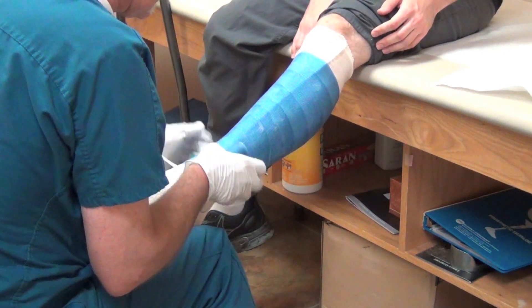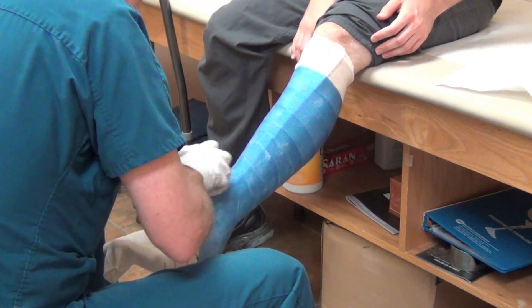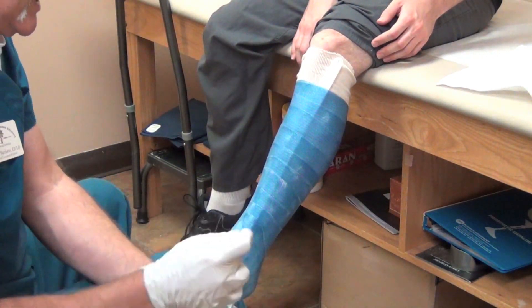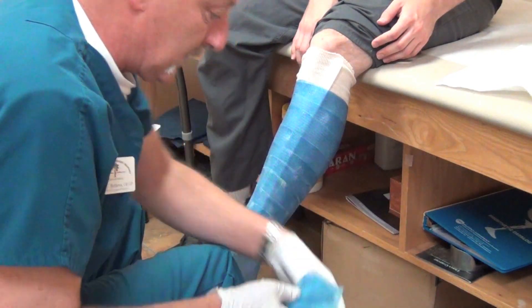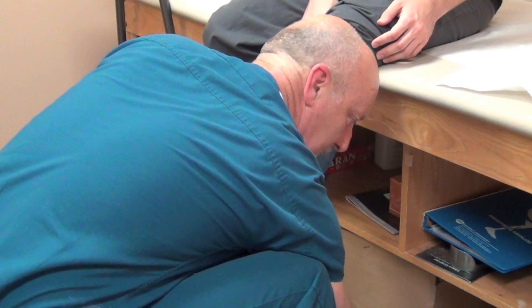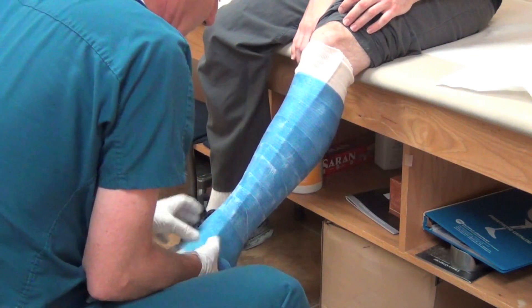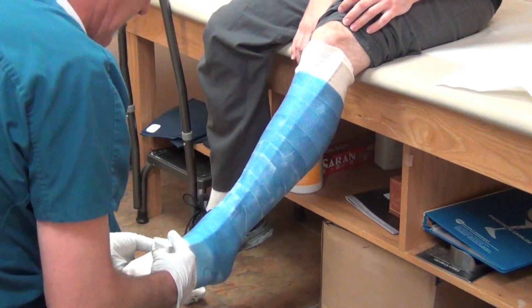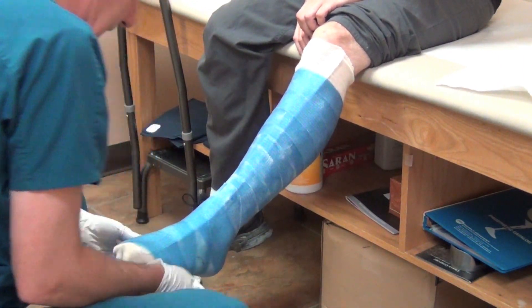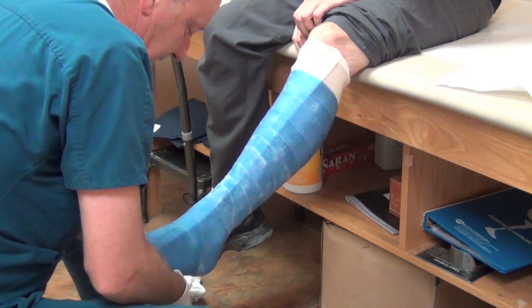The 4 inch will typically go down to the foot, and then the 3 inch will tie it in for the foot. I use warm water — pretty warm, not cool — just so it sets up quicker. If you like to work slow, like a practitioner here named Amelda, she likes to work her models a little longer and uses cool water. Then just overlap your material so it's strong.